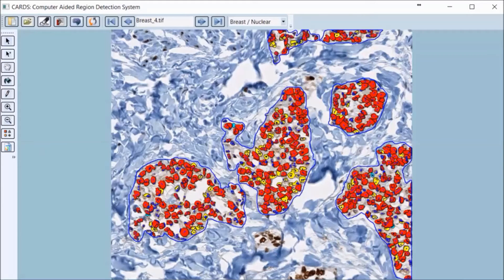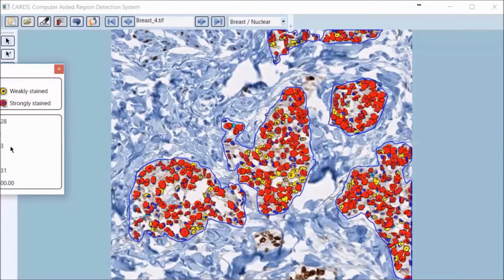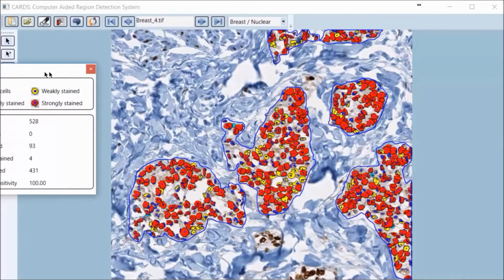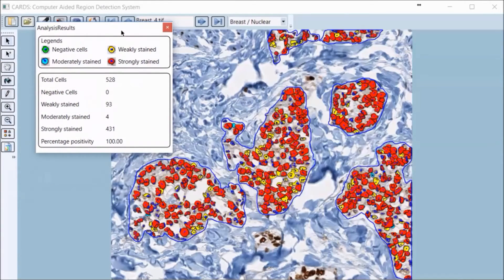The colors indicate the level of staining on the tissue. A report showing the number of cells for each level as well as the percent positivity for the test can be found here.